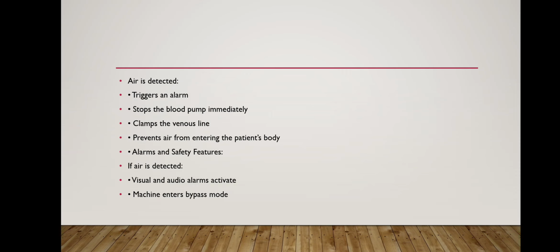When air is detected, it triggers an alarm, stops the blood pump immediately, clamps the venous line, and prevents air from entering the patient's body.